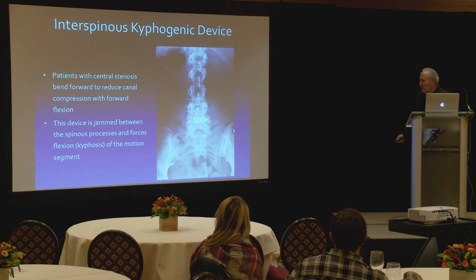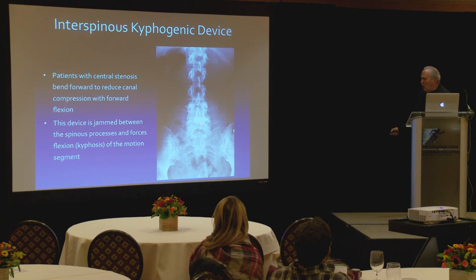So there's interspinous kyphogenic devices. I don't think any of us use them up here, but you'll find guys who want to be the latest and greatest. The whole idea with the lumbar spine, if you have stenosis, is you want to flex the body forward to open up the canal. Well, this device jams in between the two spinous processes, so it keeps the canal open only at that one level until it erodes into the spinous processes. And then now you have a painful device and you have stenosis.